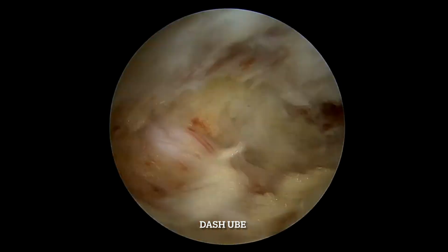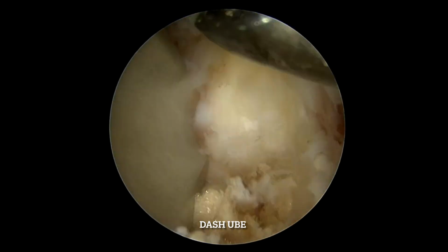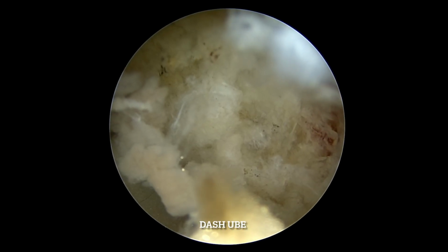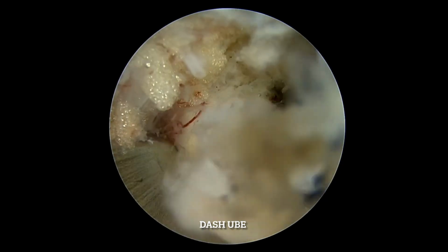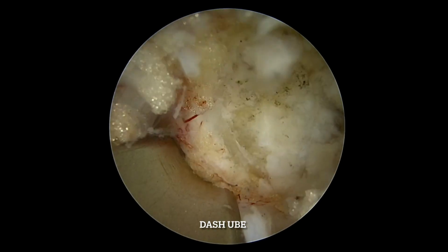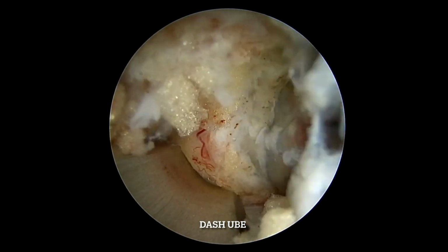I am a big fan of the curette in these phases because it protects a lot of neural structures. Once you identify the root, I am using my sheath retractor, advancing it so that it can retract the root. And this is the area where we're going to remove the disc. RFs are very handy to make the annulotomy as well as annuloplasty. Now the discectomy is carried out.